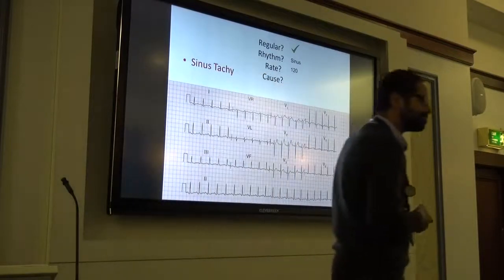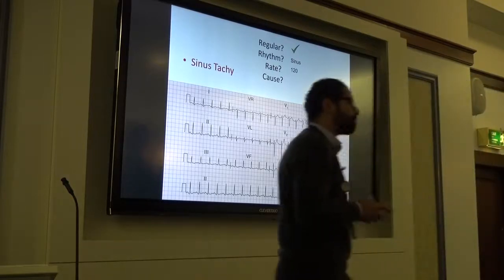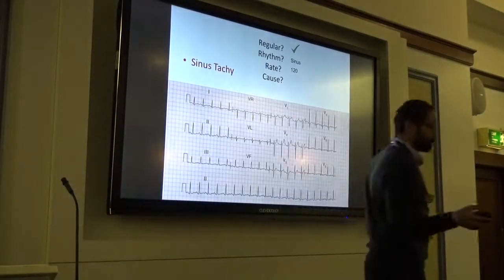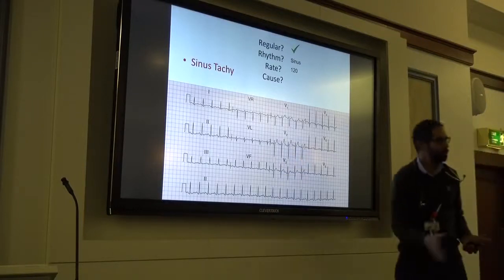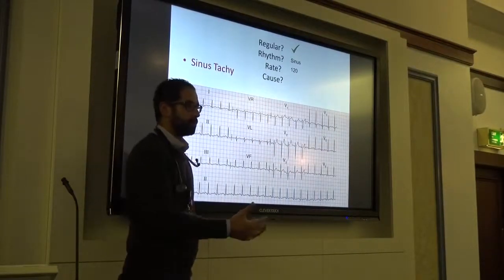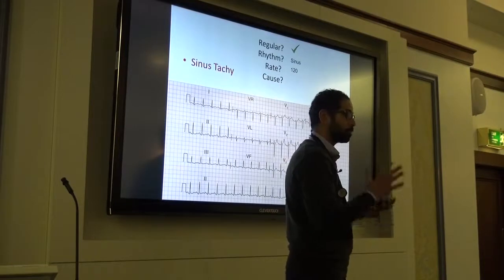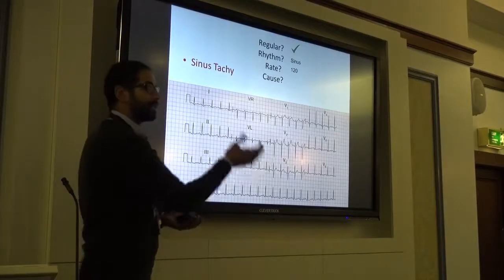Why is the T wave not important in whether it's sinus or not? Because the T wave is just a recovery wave. Do you know when people swim butterfly? You start the kick there, and then your legs have to follow with the stroke. So the T wave will come anyway, it will be dragged along. It's not initiating the impulse or controlling, it's just reacting. This is why in ischemia the T wave gets flipped, because it's just reacting to the actual problem, which is the ST elevation. It's a kind of mirror image, as if you flipped everything around. The T waves are just getting dragged along.